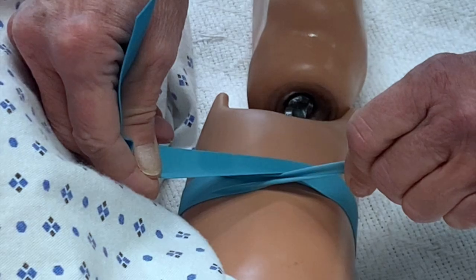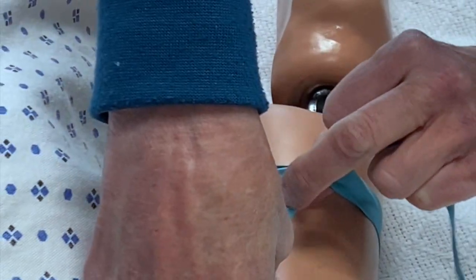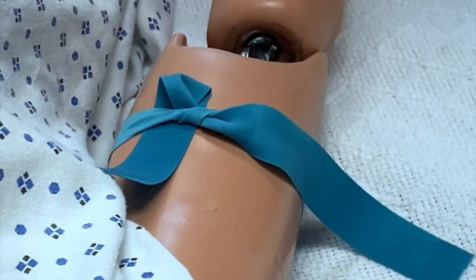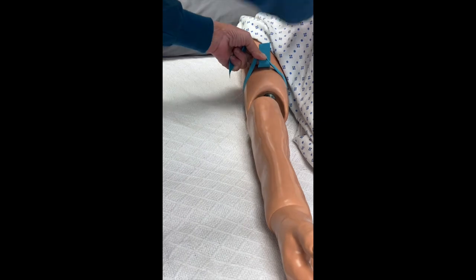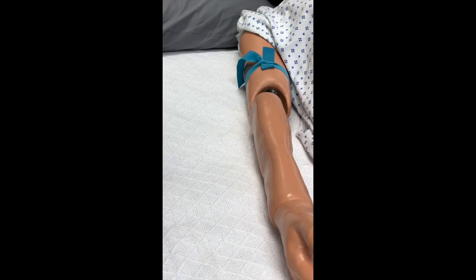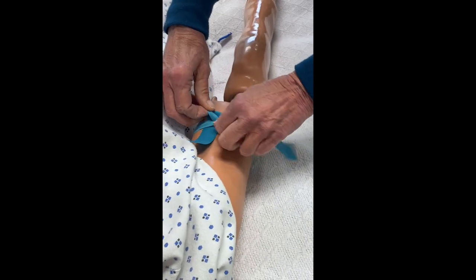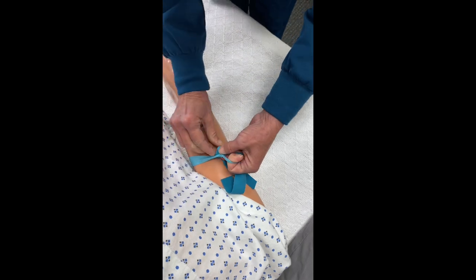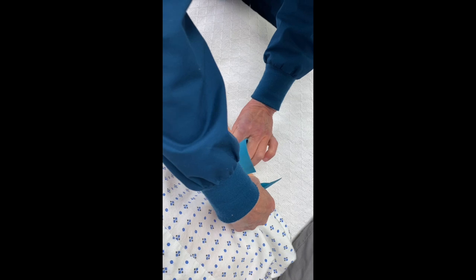Step three: raise your dominant hand up, pulling the tourniquet away from the arm. Now use your non-dominant thumb to lift the X away from the arm. This will allow you to tuck the bottom half of the tourniquet under the X, making a loop. Make sure the top half of the tourniquet remains above the X.